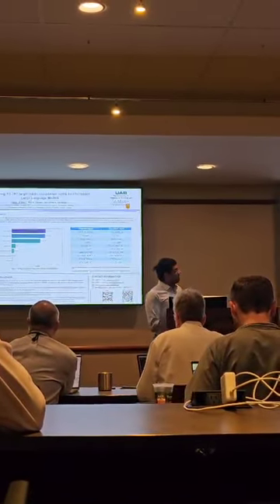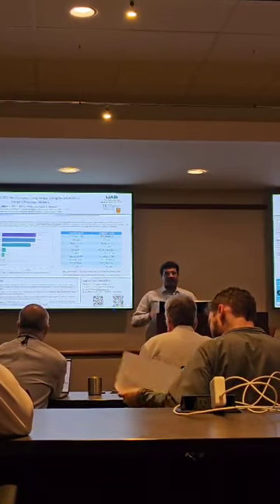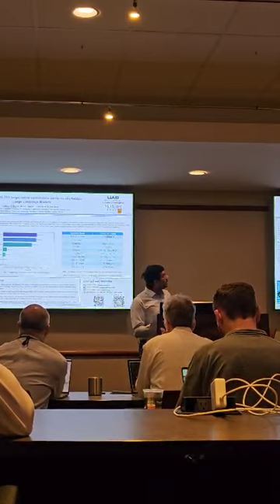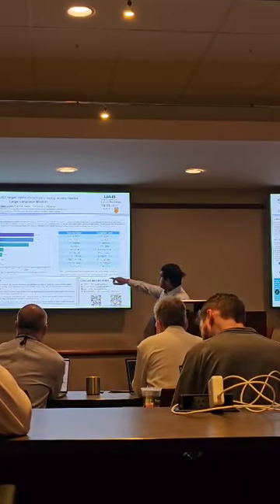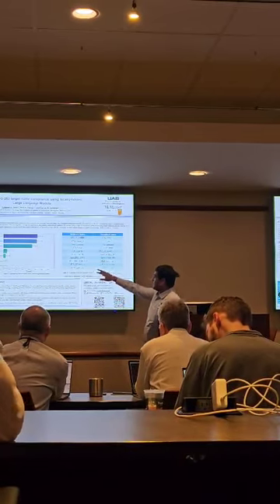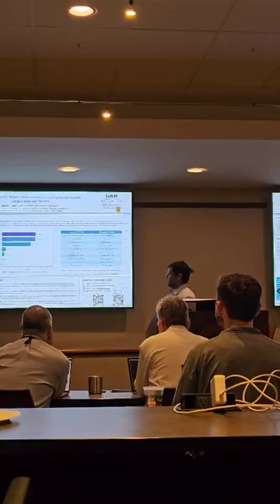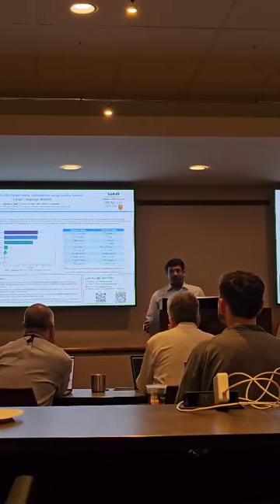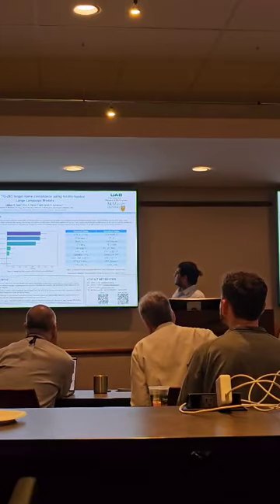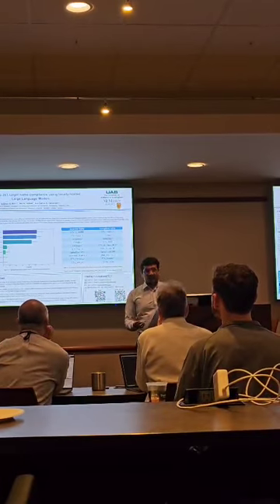Now the issue is not all compliant names are built the same. We can have a name that's compliant that doesn't necessarily reflect what the initial physician meaning was. So I'll give you an example here. The PTV_RT space femur is not correct in accordance with the TG263 requirements. PTV_femurs is correct under TG263, but as you can see, it misses out the laterality information of RT, which is right in this case.